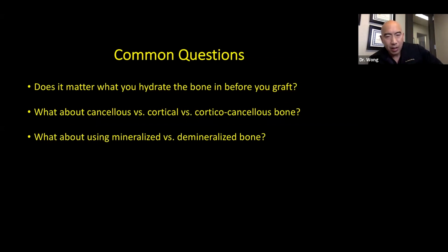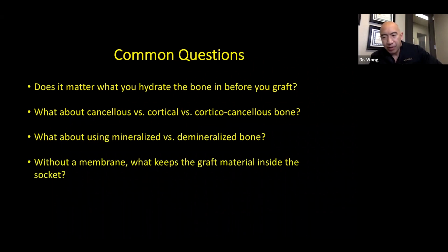You're going to use mineralized bone though. And the reason why you're going to use mineralized bone over demineralized bone is because it lasts longer. And with grafts, size defects like sockets, you want something that lasts longer.